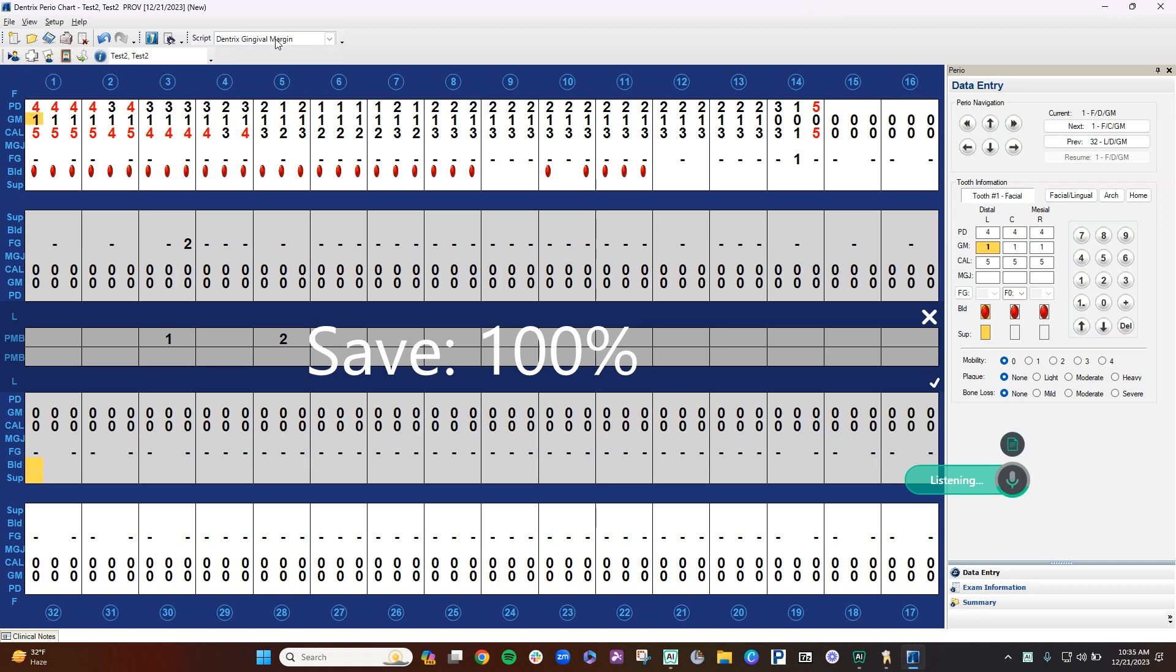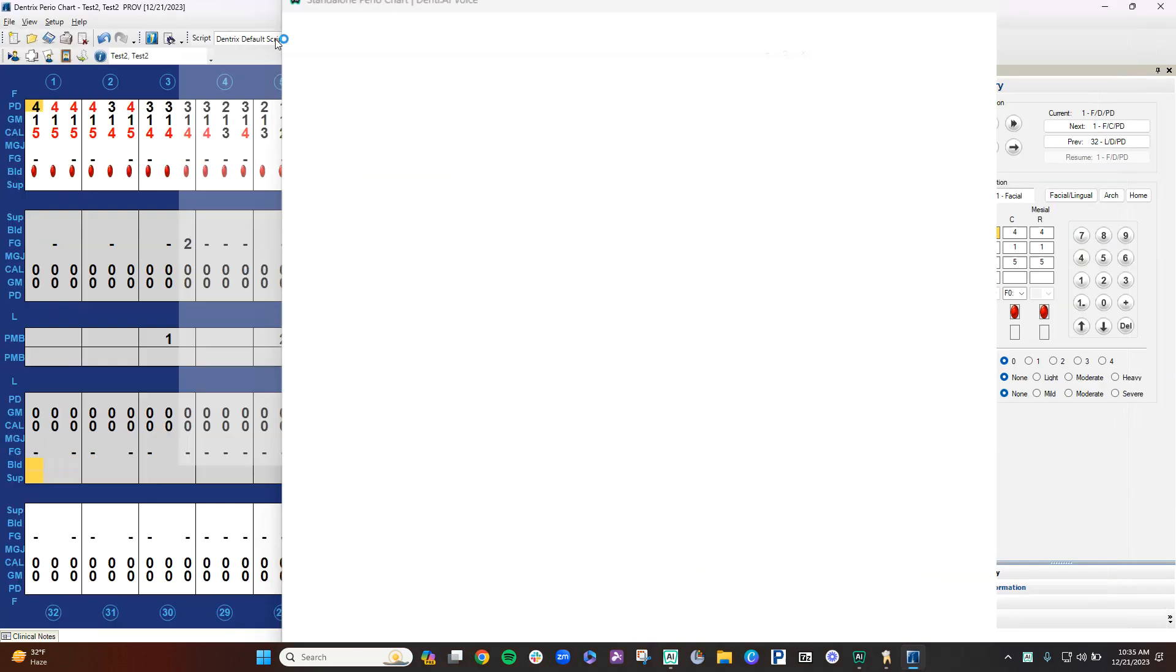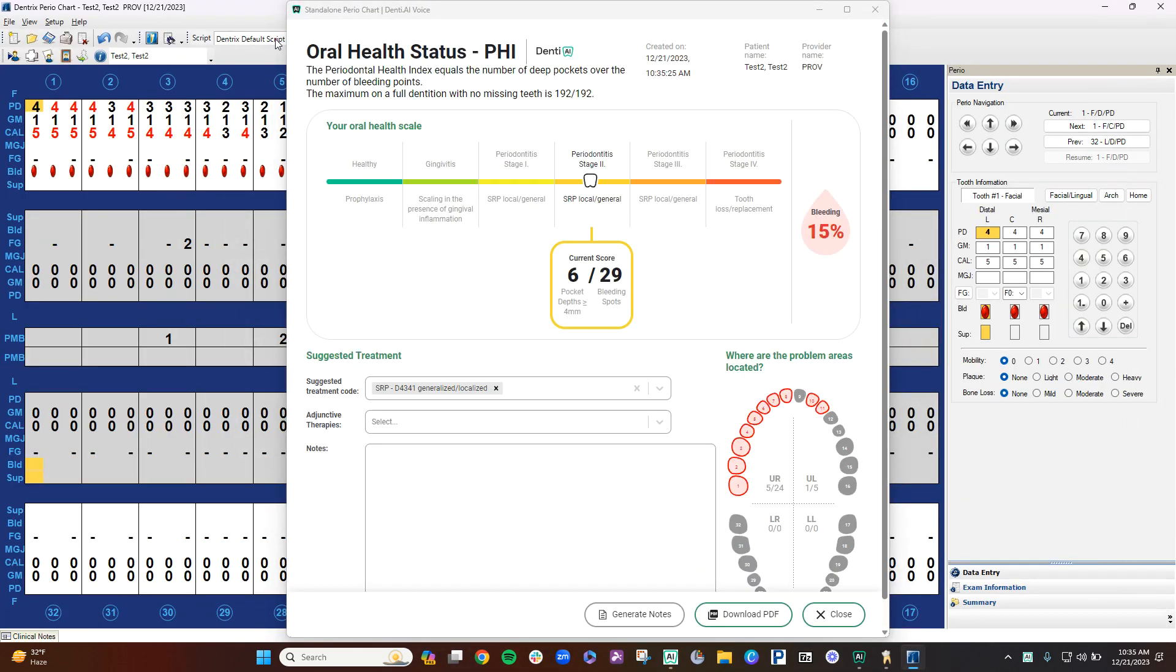As you can see, once I said save chart, it auto-generated zeros for any area I didn't fill in. This is nice for gingival margin especially because you can spot check recession and then it will auto-generate the zeros. This is needed because we need a complete full perio chart in order to get the accurate clinical attachment level because this is how we stage the patient.